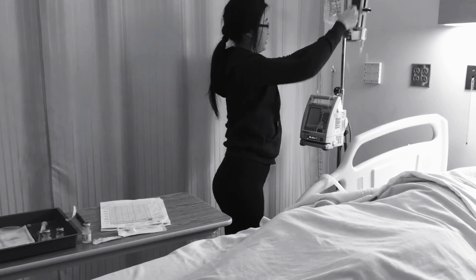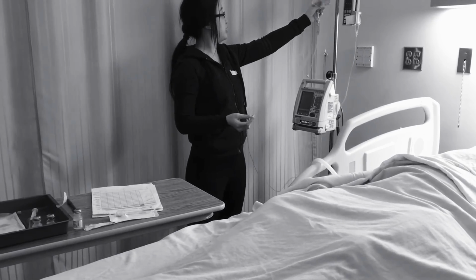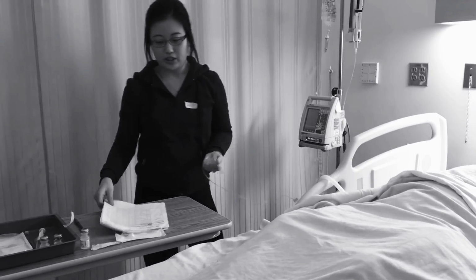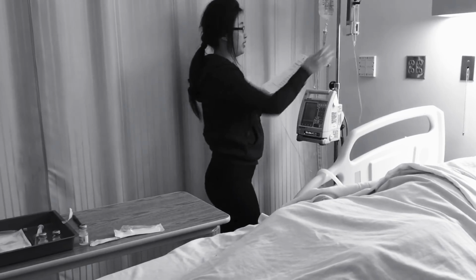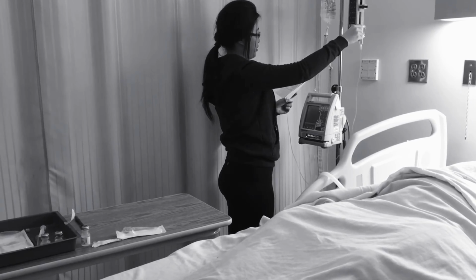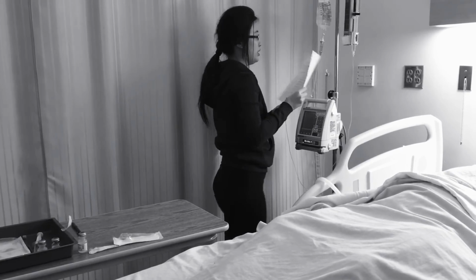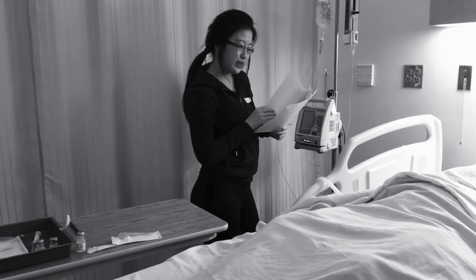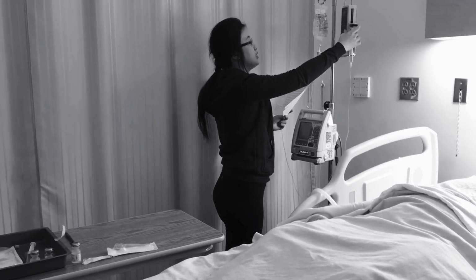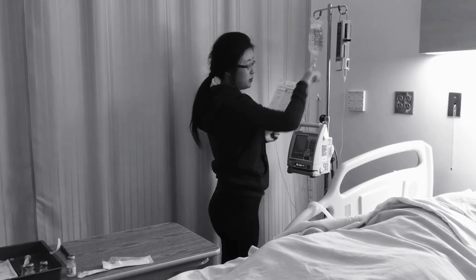And before I start it, I'm going to make sure that the primary is not expired, and it is not, it is good, and it's still flowing. And then I'm going to do my third check with the label that I made and my syringe. So it is 200 mgs, make 10 mLs, which I have in here, and it will be delivered in 26 minutes, which I have here, which was in the CIVA chart. So that correlates with what's on there, and it'll be a normal speed.